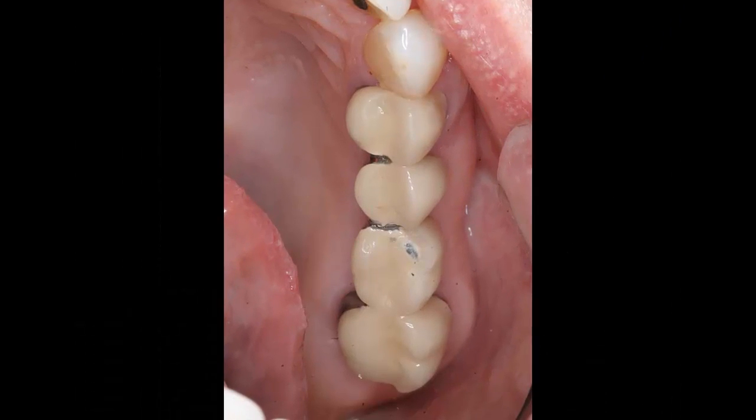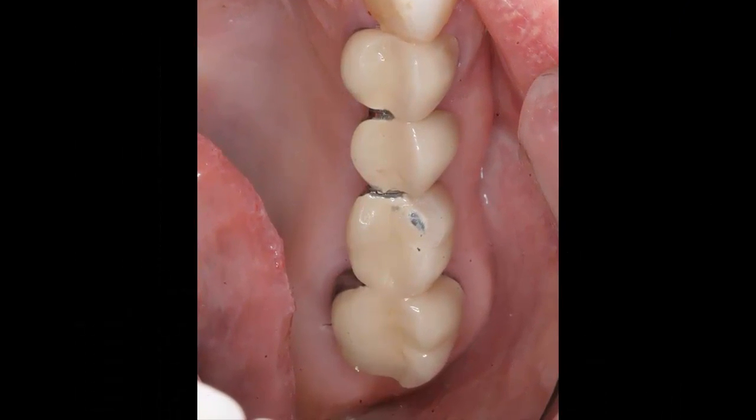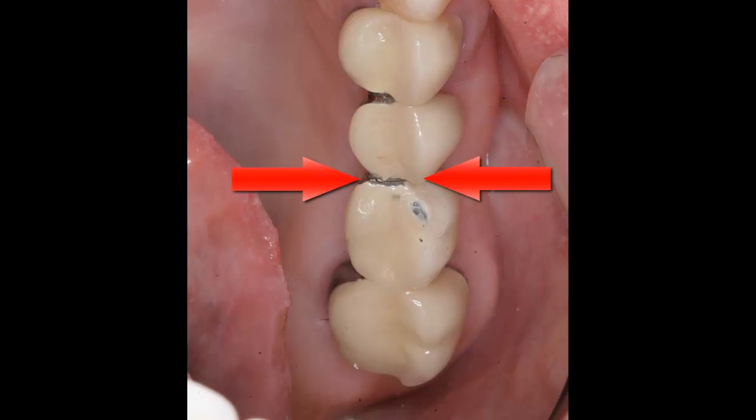Clinical examination showed a fracture between the two unsupported pontic replacement teeth. The fracture, plus the bone loss on the back anchor tooth, accounted for the bridge's looseness and discomfort during chewing.